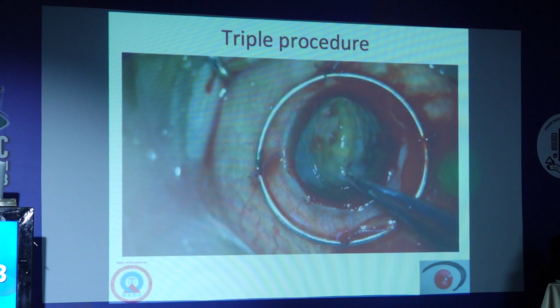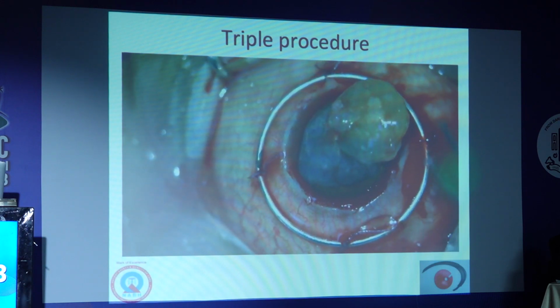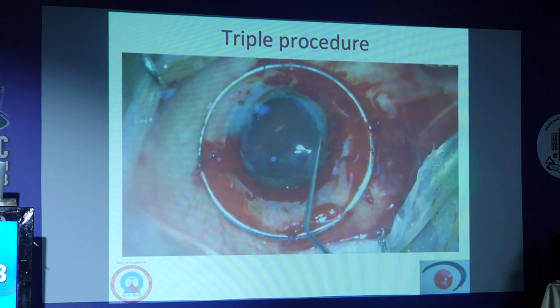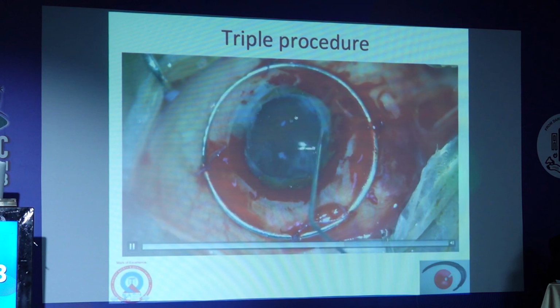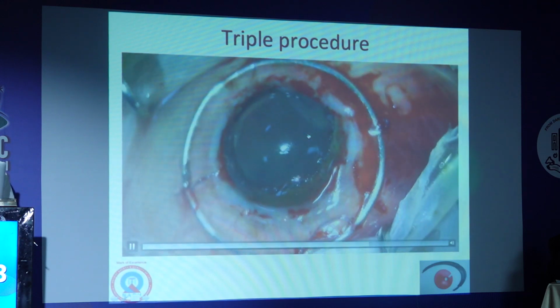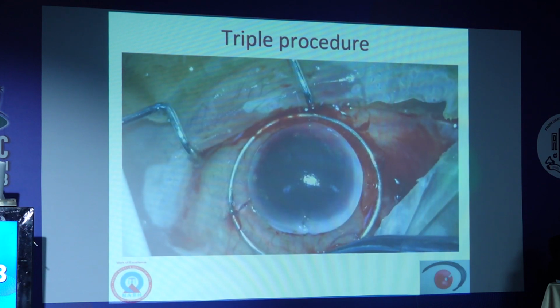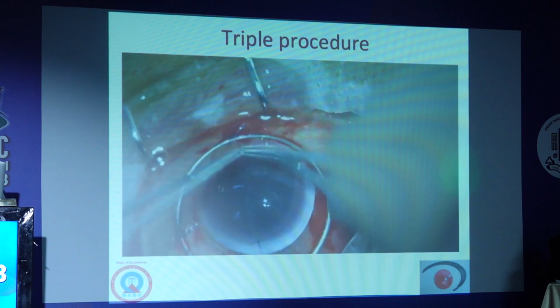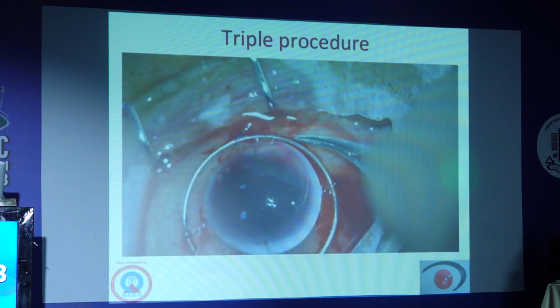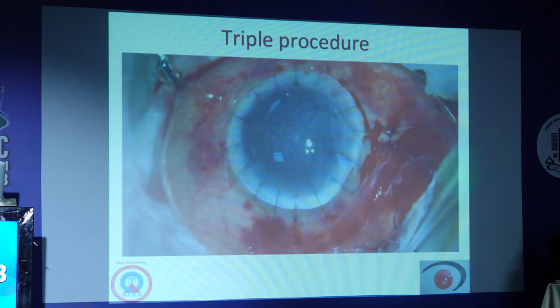You can see the lens is already out, and because the capsule was ruptured, we just remove the lens. With the Flieringa ring, the surgery becomes very simple. If it is not there, the globe will keep collapsing and the risk of choroidal hemorrhage is there. So, a large graft. And we have to size the Flieringa ring depending on the graft size that we are going to take.